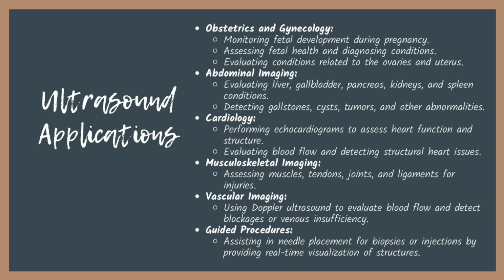It's used in cardiology to perform echocardiograms, which assess heart function and structure. It can also evaluate blood flow and detect structural heart issues. It's used in musculoskeletal imaging, so it can assess muscles, tendons, joints, ligaments. We can be looking for injuries. It's used in vascular imaging to evaluate blood flow and detect blockages or venous insufficiency. And then it's also used in guided procedures. For example, assisting in needle placement for IV access or even biopsies by providing real-time visualizations of the structures.